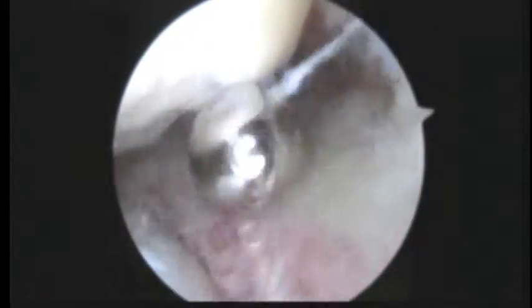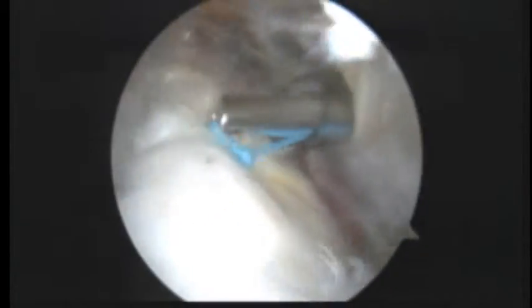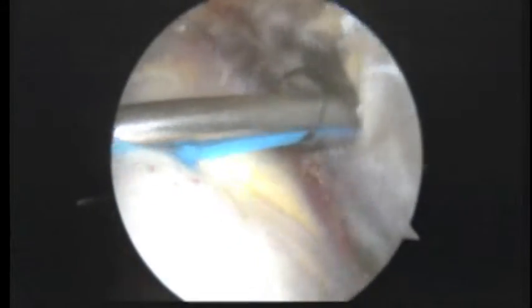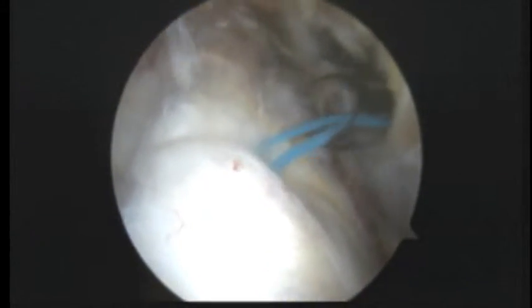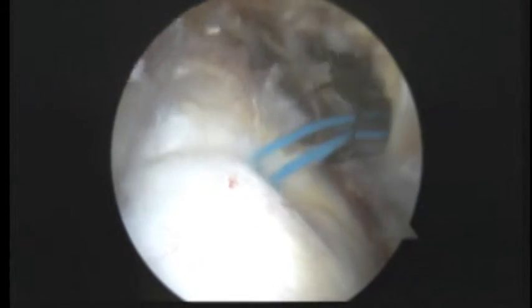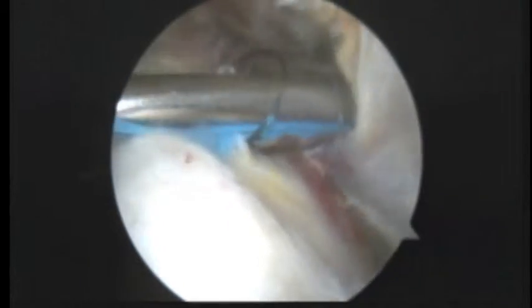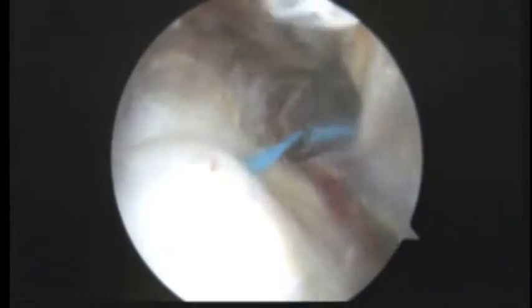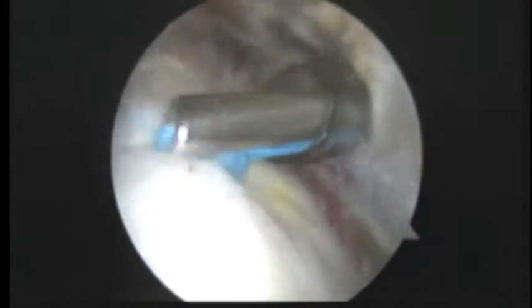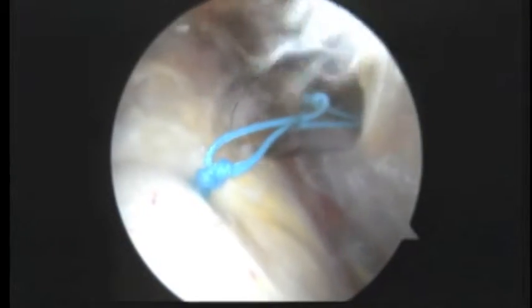We will go ahead and get to work on the rotator cuff tear in just a minute. Okay, so we're just showing you how we tie down the tendon to the bone. This is the first suture from an anchor that has three sutures, and we're just tying this knot here.